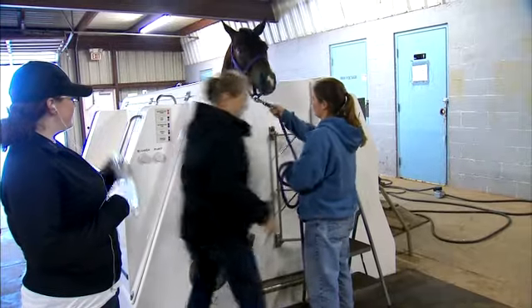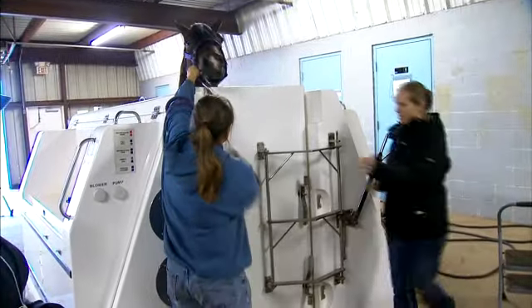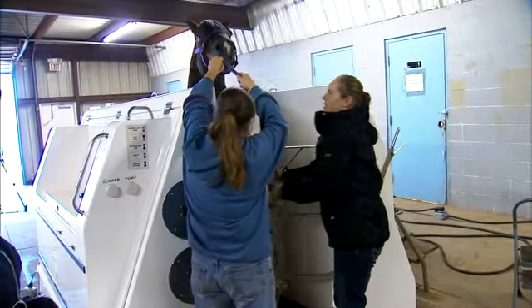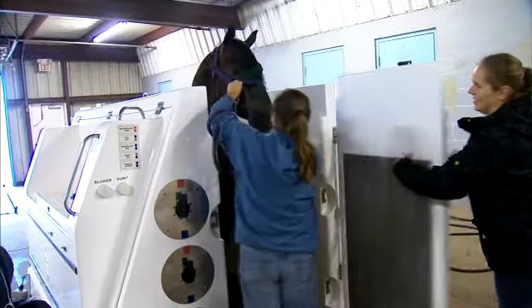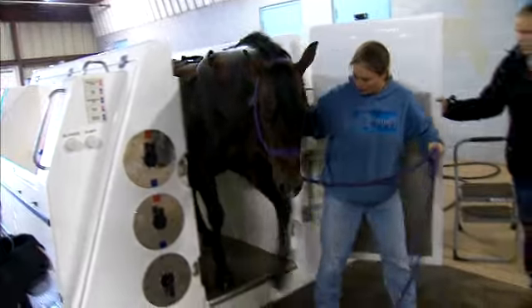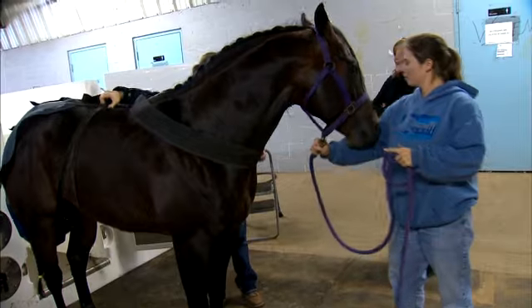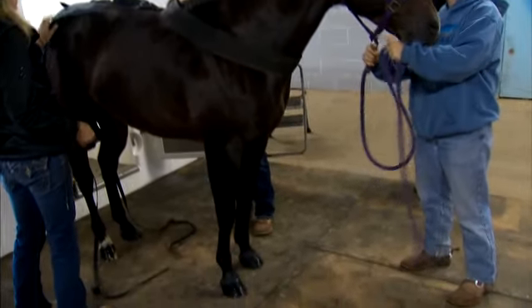The popularity of the devices continues to grow and can be found in several clinics around the country. The cost is relatively inexpensive, ranging from $50 to $75 per treatment. With the water just above freezing, it never gets higher than their knees and hocks. Any higher could cause problems or even hypothermia, a fact not lost on jockeys sitting around waiting for their next race. We did have a jockey contest at Remington Park last spring, and the toughest jockey could only stay in at 1 minute and 45 seconds, which is actually a long time when you're talking about 35-degree water.